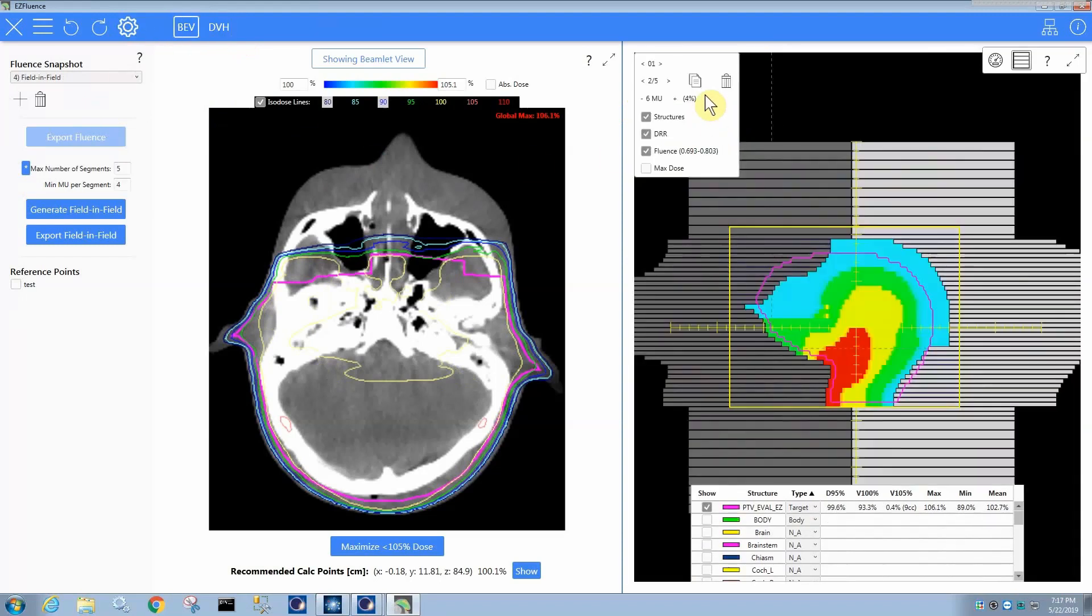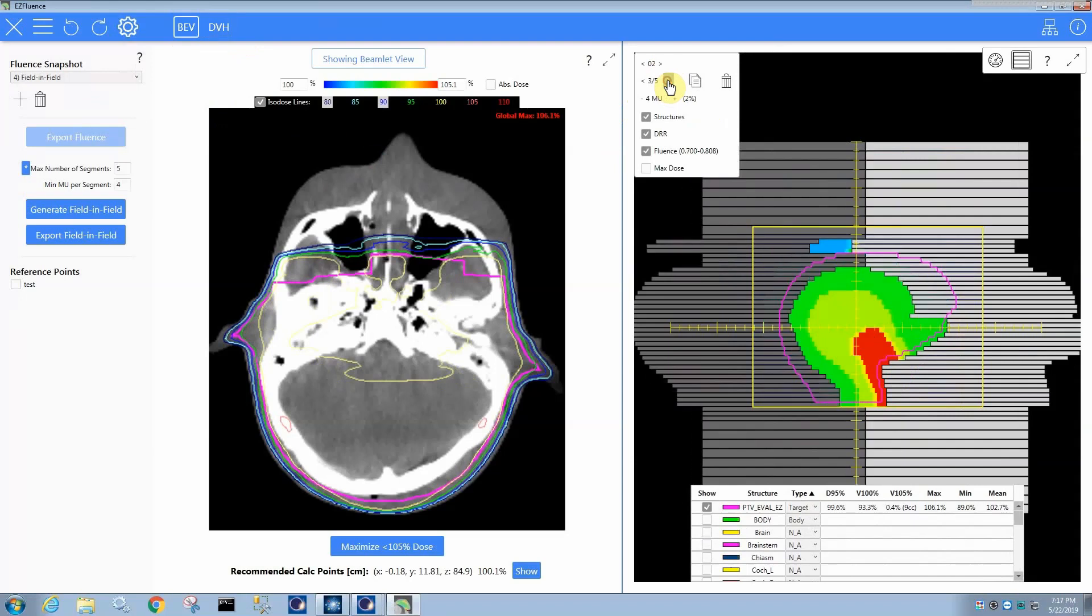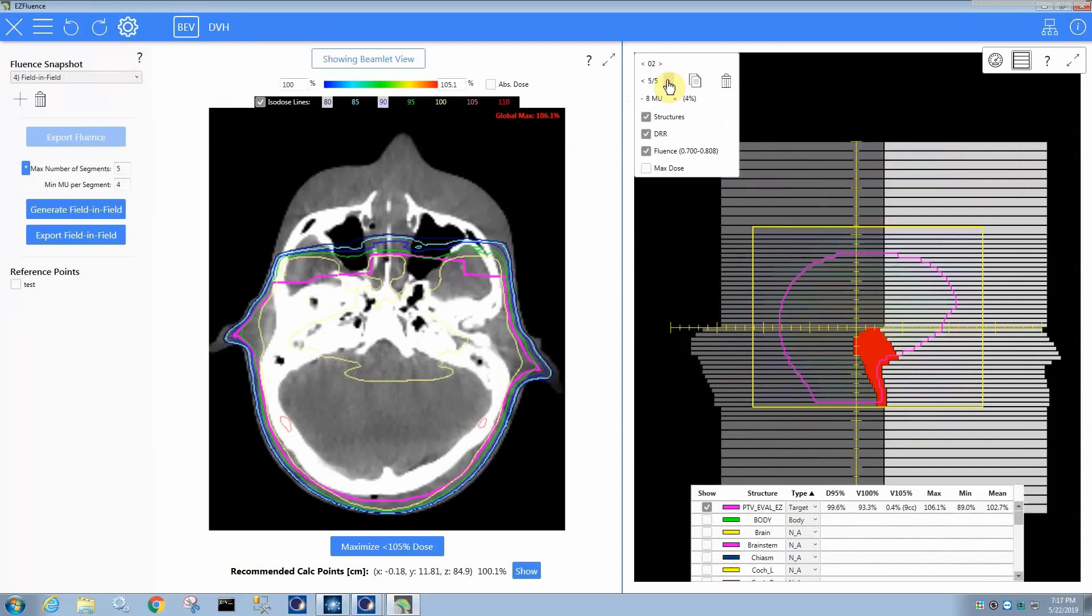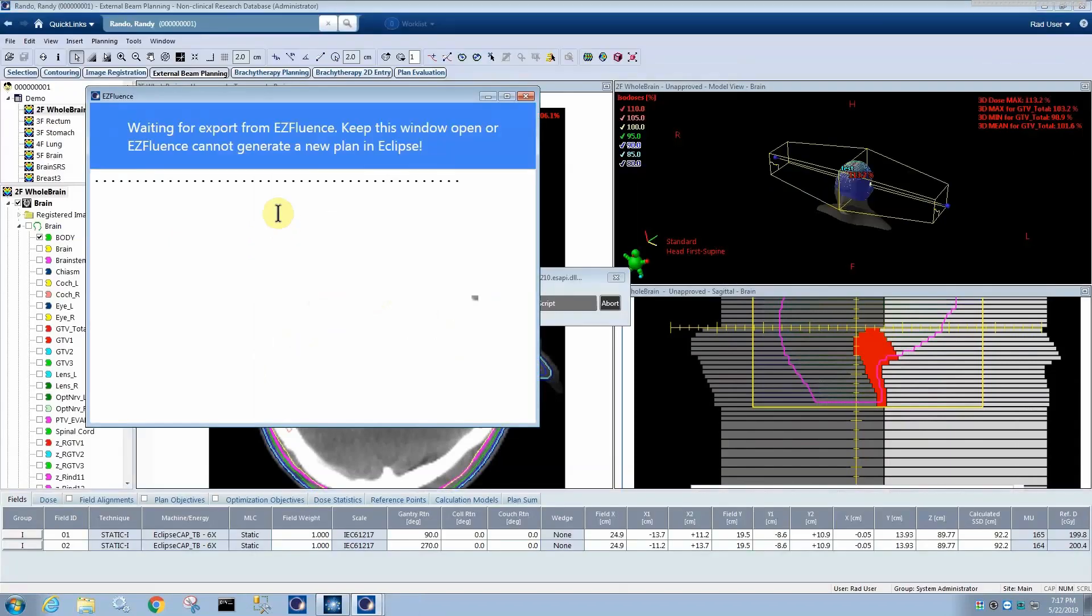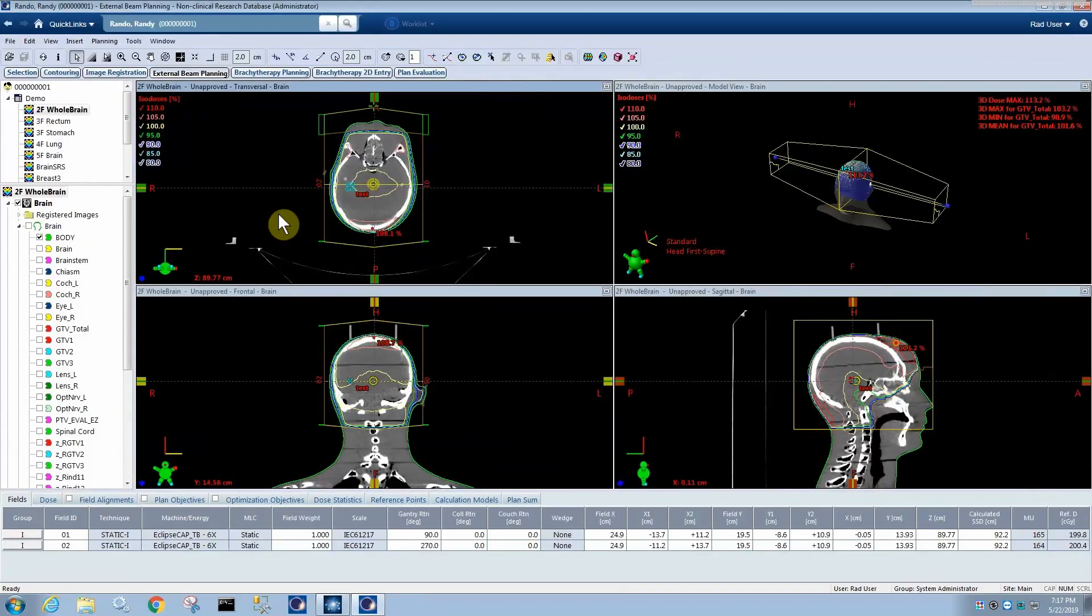Now the subfields, of course, you can review and see if you like what it's doing or not, and then export it to Eclipse. So that is the parallel posed two field, which EasyFluence since version 1.4 could do this and do it well.